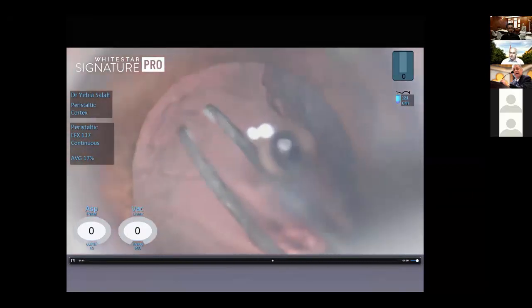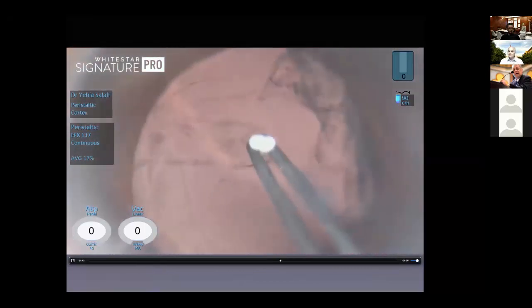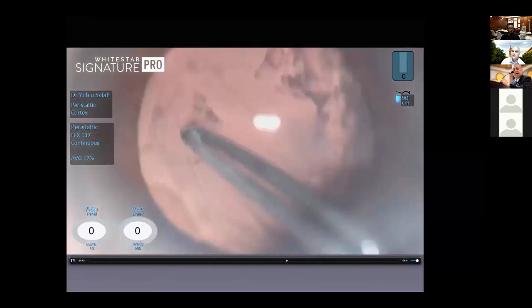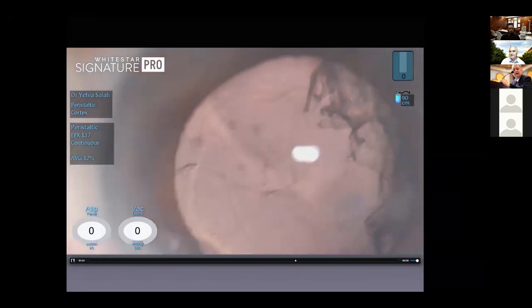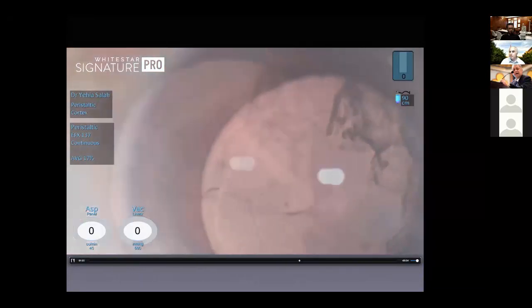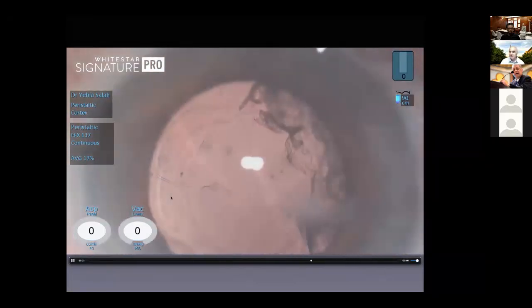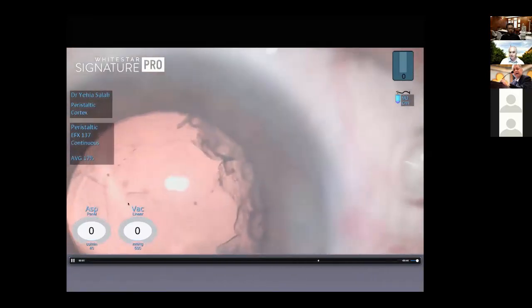And with good magnification and control, you can convert the ellipse tear that can easily extend into a round posterior capsular tear. Once you do this, then you can make sure that you are going to implant the lens in the bag. I still have cortex here. I'm now injecting viscoelastic to push the vitreous back and inflate what is remaining of the bag. I have the capsular edge anterior here.